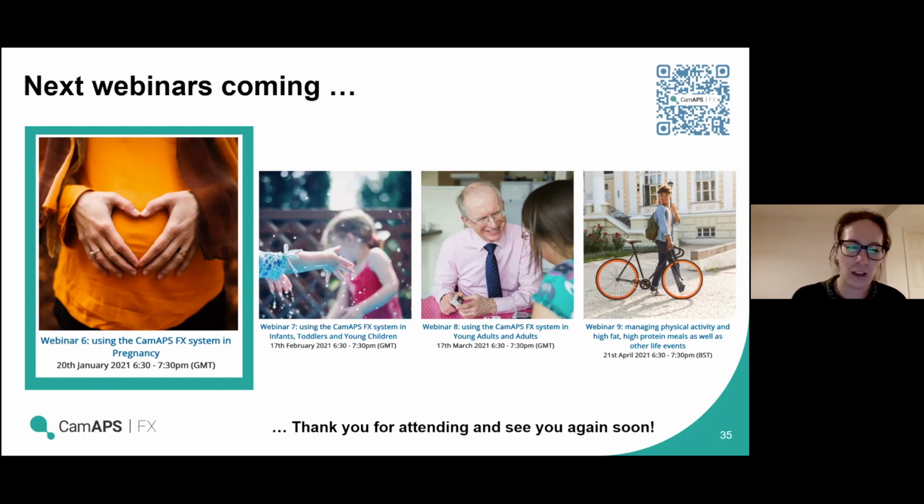I think changing the personal glucose target I would keep for more trends over a period of time, and small differences in it. So going from 5.8 to 6 probably makes very little difference. If you really want to raise a target, I would be going up to 7.5, 8 in the first instance probably, and then see how the dust settles, wait a couple of days, and then re-review at that point. Yeah. Thanks, Charlotte.